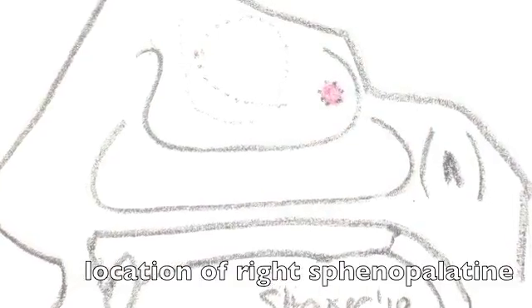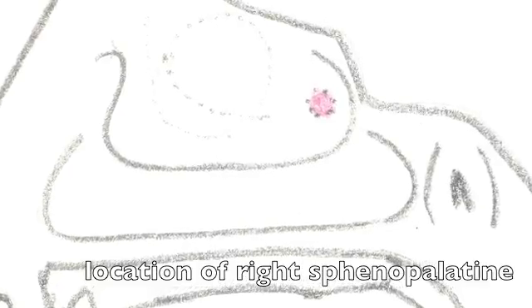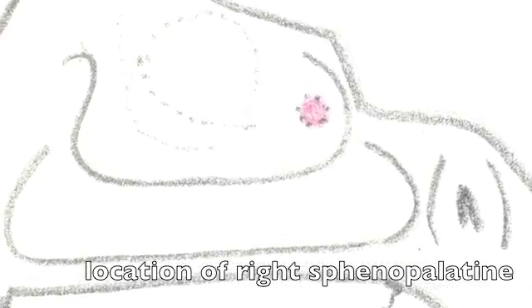The location of the sphenopalatine artery exiting through the sphenopalatine foramen is seen here. It is below the posterior aspect of the middle turbinate.